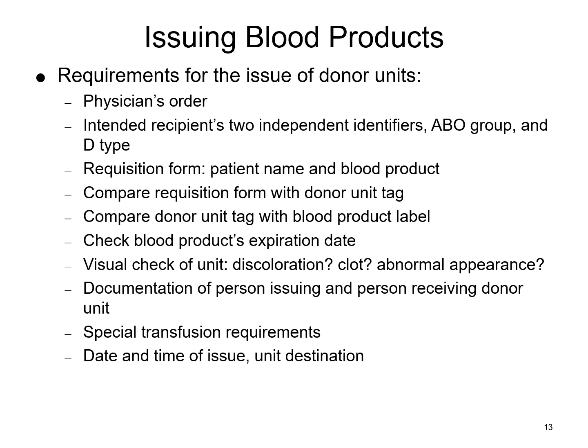Now that requisition form, that request from the nursing floor, OR, ER, wherever, has to include the patient's name and the product that they are requesting. They have to tell you what they're requesting, because you may have multiple things set up on that patient. You may have red cells, fresh frozen, and platelets, and cryo, and RhoGAM.